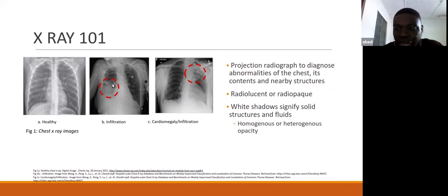Now, this looks like a foreign material in the chest X-ray. This could either be pus or a clot or anything. It's an infiltrate. It's something foreign to the lung field. In the natural sense, all this should be filled with just air, right? But we have this mass right here, so this is picked up as a white structure. Now, these dots and lines you see in here are actually electrodes. I think this person has been kept on an electrocardiogram, right? So these are just the electrodes.